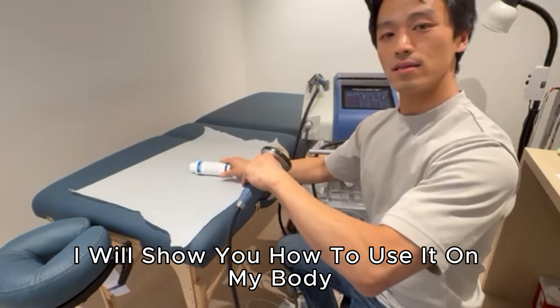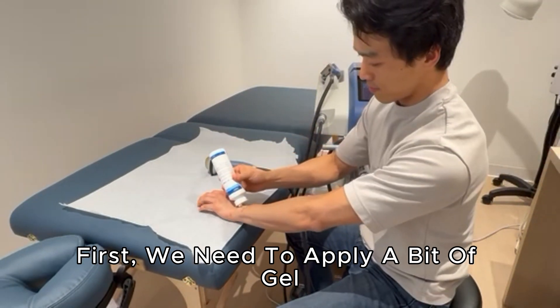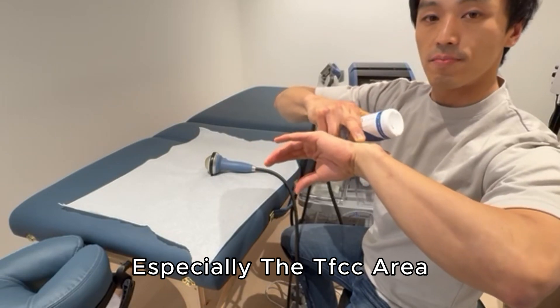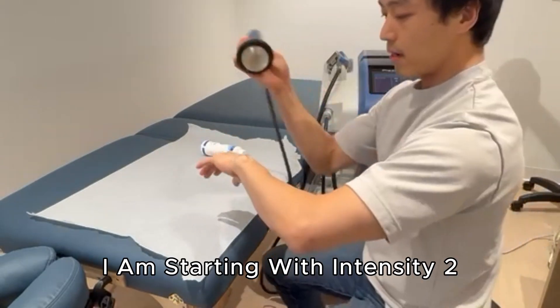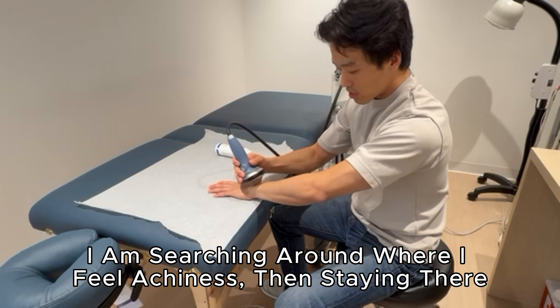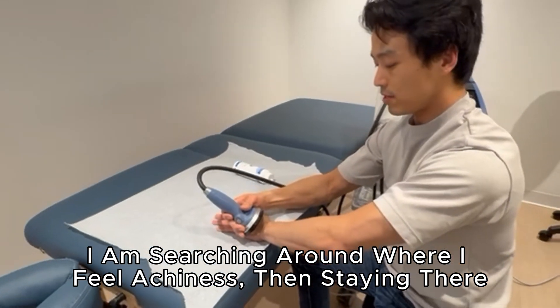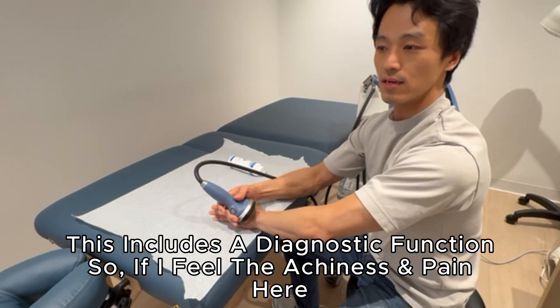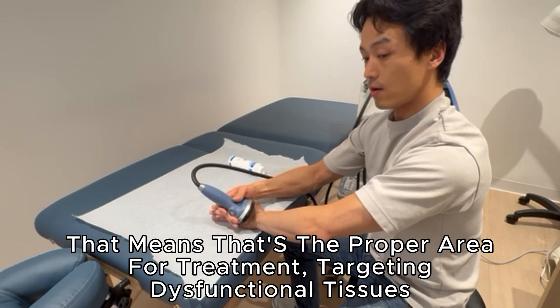I'm going to show you how to use it on my body. I need a little gel, then I apply it to my wrist area — especially the TFCC area, which is very common for dysfunctional tissue. I start with intensity 2 and search around for where I feel achiness. As I mentioned, this machine has a diagnostic function: wherever I feel achiness is the area with dysfunctional tissue.